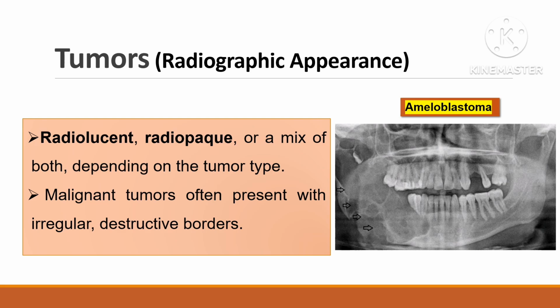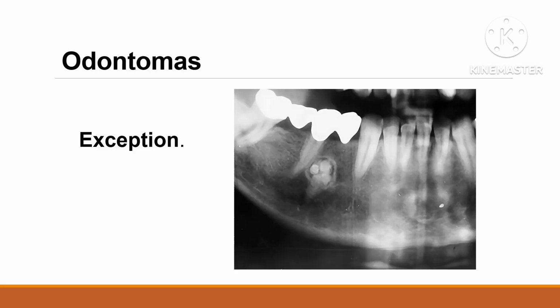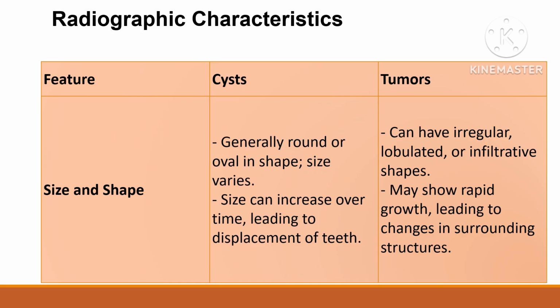Ameloblastoma appears as a radiolucent soap bubble or honeycomb appearance in the radiograph. With the exception of odontoma, although it is classified as a tumor, it appears as a radiopaque mass due to the presence of dental hard tissues.